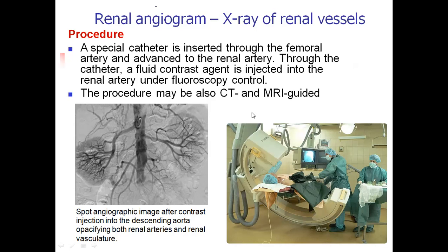After placement at the beginning of the renal arteries, contrast agent is injected into the distal aorta or directly into renal arteries, and a series of X-ray films or video may be taken.